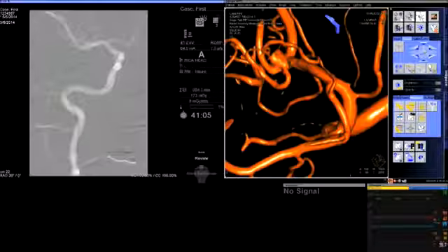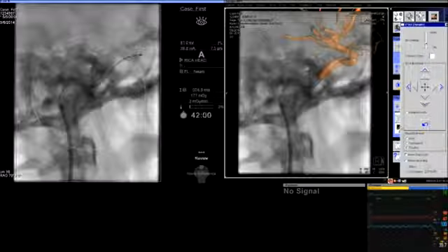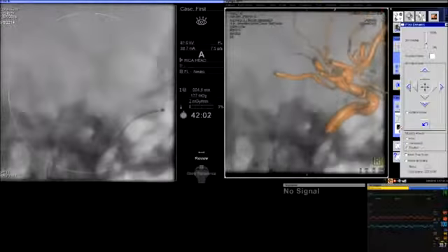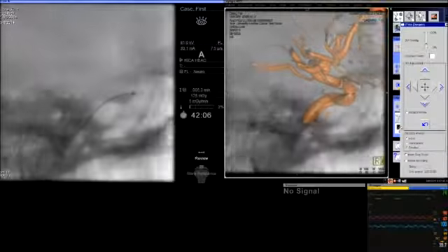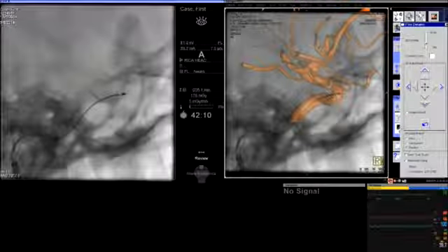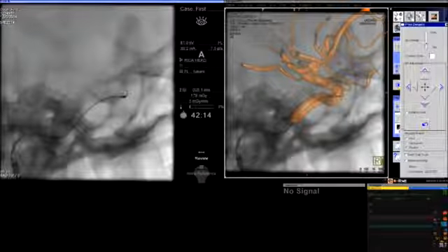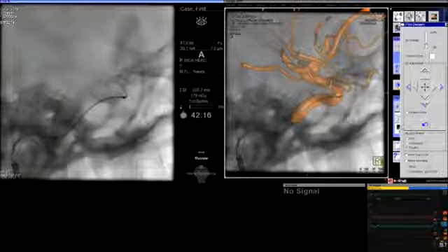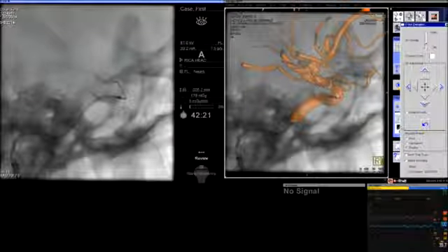treatment. The anatomy of this bifurcation has to be clearly defined, and the 3D angiography is very important in this assessment. Because of the complexity of this anatomy, we decided to use a ProSelect Plus and a Synchro wire to catheterize, and perhaps this is one of the most important tips of this technique: always consider to catheterize first the most challenging vessel of the bifurcation.